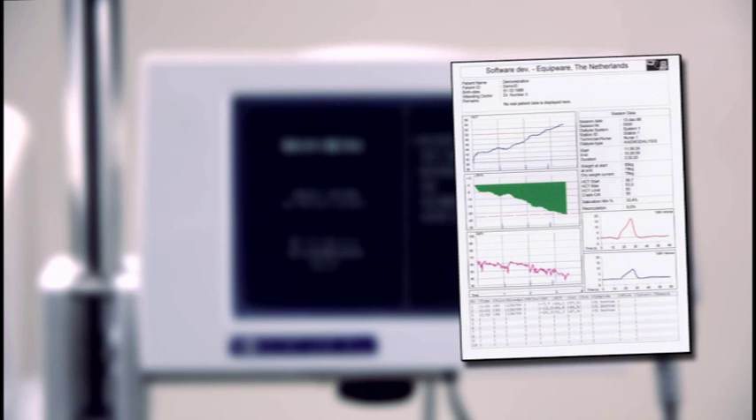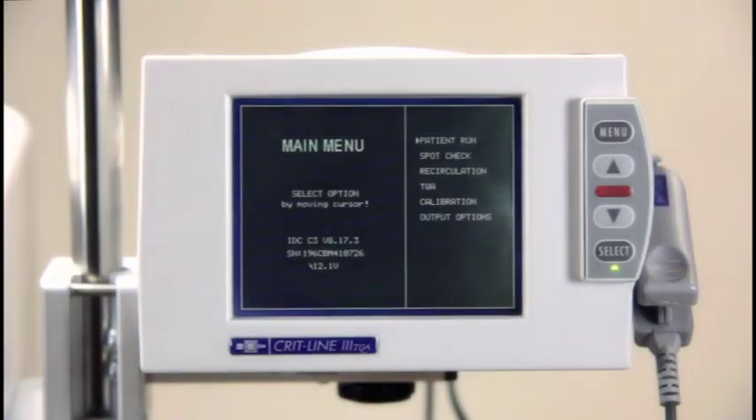The header information above the profiles will include the patient's name and ID number if entered into the CRITLINE monitor prior to treatment. In addition, the header information includes the patient's starting hematocrit, maximum hematocrit, hematocrit limit if entered, starting hemoglobin, station number if entered, date of treatment, along with the start time and end time of the treatment. The header information also includes the serial number and software version of the CRITLINE monitor along with the original calibration date and last verification date.